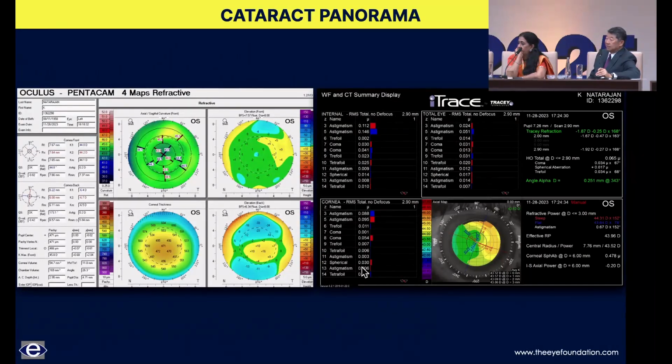One of the biggest benefits is that the patient doesn't have to decide between rings or being unable to see their cell phone. It's been really excellent in terms of the outcomes, giving them binocularity across distance and intermediate. We have this problem with people having trouble deciding because you have two really good choices that aren't perfect, and that's been a real change.